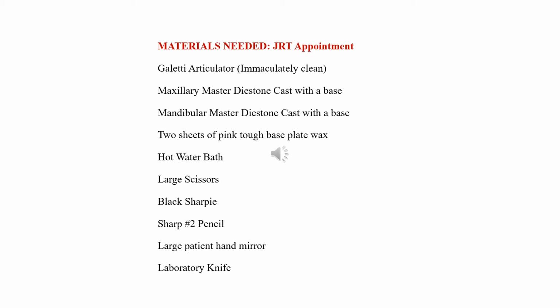You only really need to use one, and you'll learn how to fold the pink, tough base plate wax and then fit it to the upper jaw and trim it custom to that patient's upper jaw. And the patient's upper jaw is on the maxillary master die stone cast. So you gently place the warm wax very slightly on the maxillary cast and cut everything extra away so it fits beautifully onto the teeth.